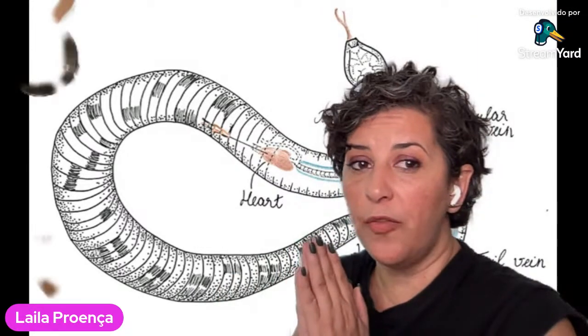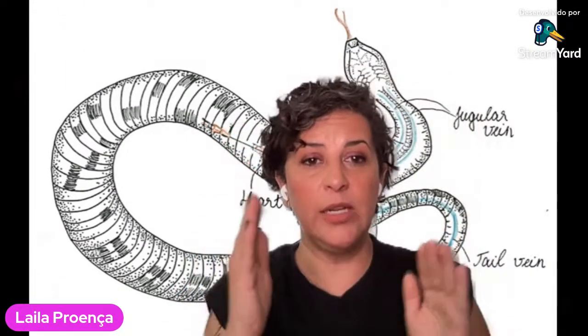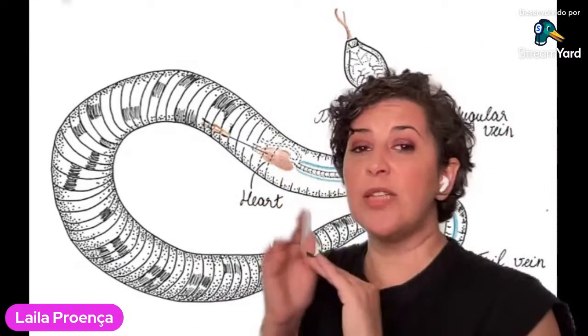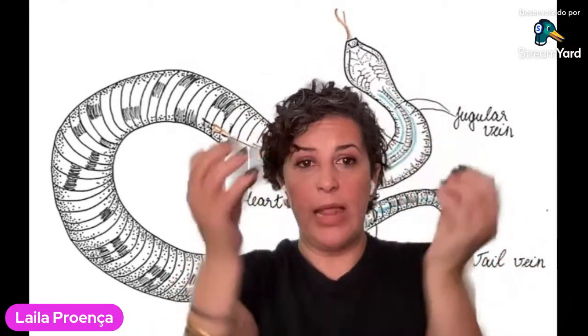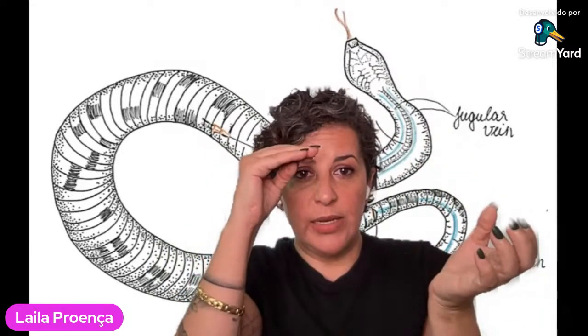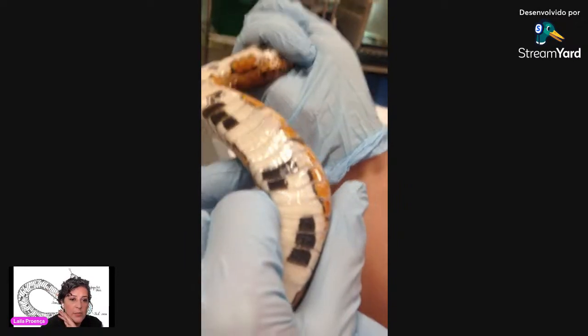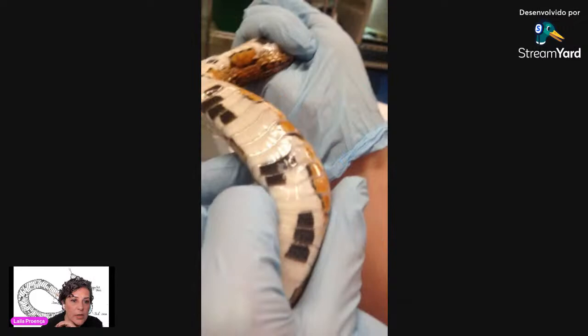Now, one rule of thumb is if you divide the snake in thirds, usually the middle to the caudal end of the first third is the location of the heart, as you can see here. It depends on the species, that's why I'm giving you these ranges. Also, if you hold the snake with the belly up, you can see the heart beating. Let me try to show you guys a video. You can also use the ultrasound or the Doppler to find the location of the heart. If you look there, you're going to be able to see it beating.